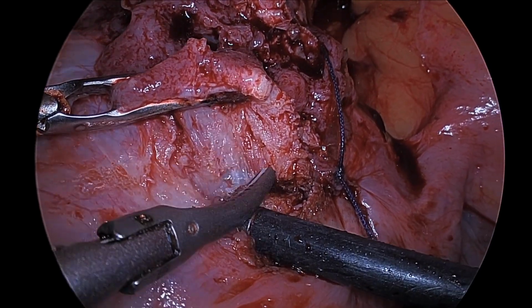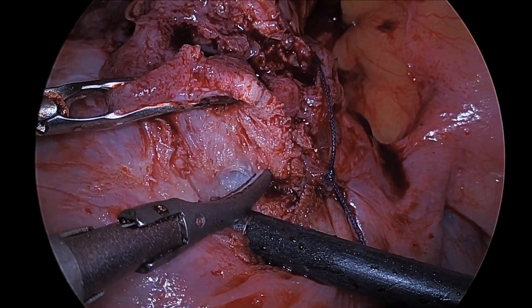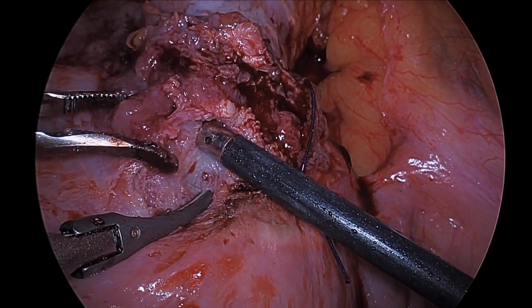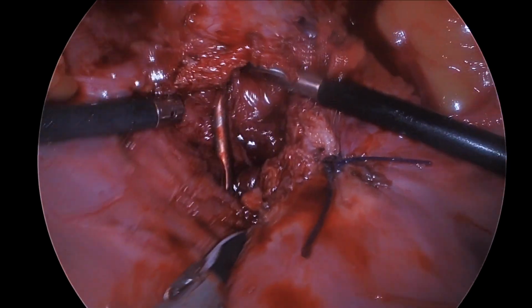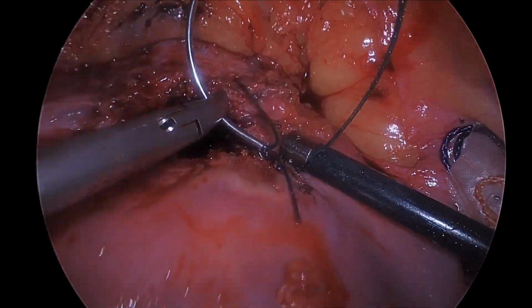The isthmocele was further dissected from the anterior aspect, again taking care to follow the direction of the isthmocele rather than a perpendicular wedge that would resect a significant amount of normal myometrium. Inspection of the isthmocele dissection site confirms complete excision. The uterine manipulator helps to clearly define the anterior and posterior walls during closure.